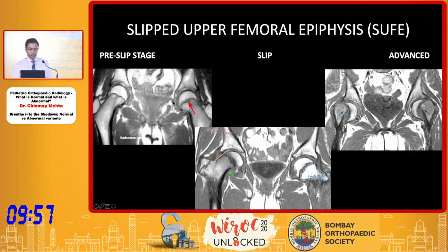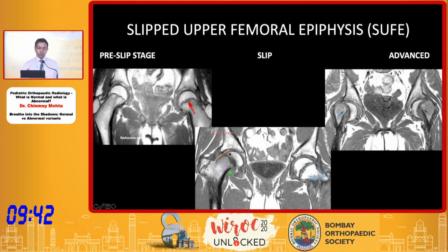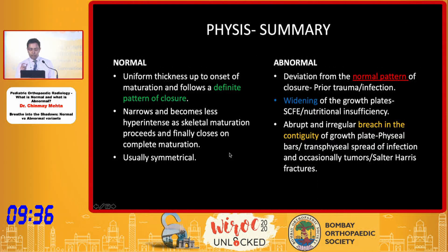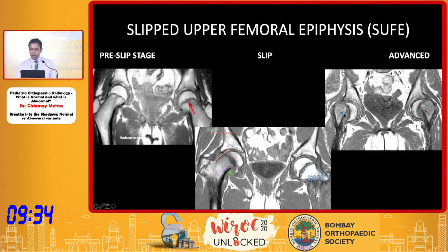Coming to the third example — this is SUFE, slipped upper femoral epiphysis. The normal physis is on the right side, whereas on the left side it is widened and irregular. This is the pre-slip stage; this is the slip stage wherein the Klein's line doesn't intersect the physis on the medial aspect — the physis is slipped medially. In the advanced stage the epiphysis is completely displaced medially.